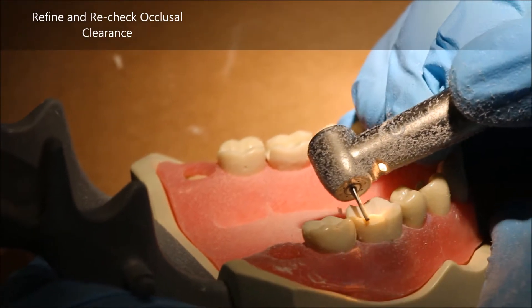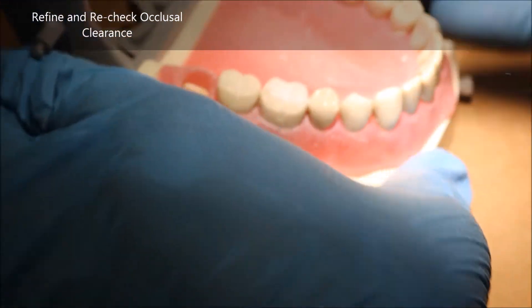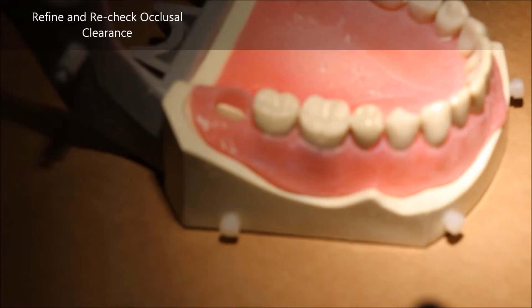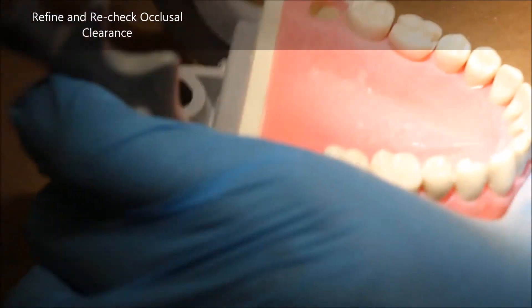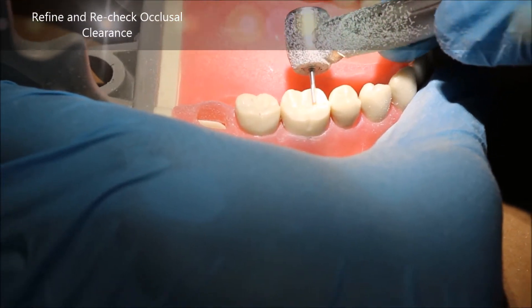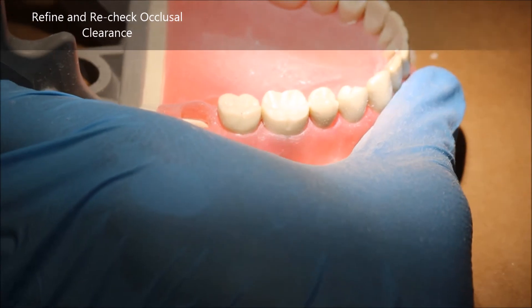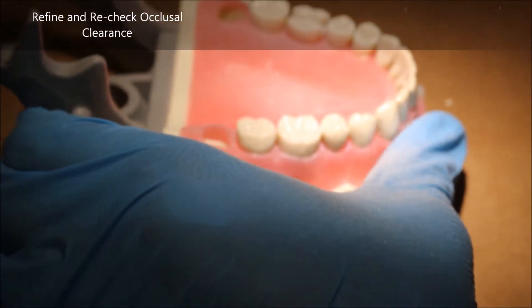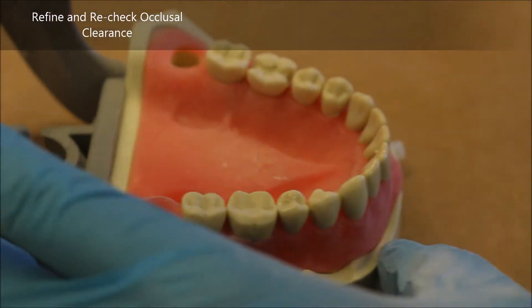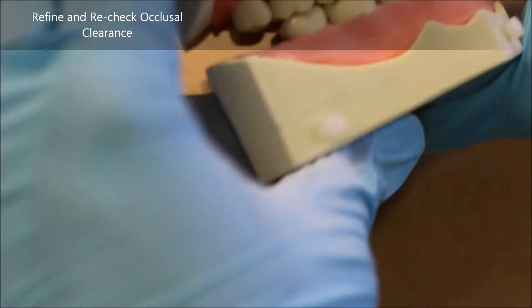Another important thing to remember during occlusal reduction is that you don't actually need to go all the way to the ends of the occlusal table. By the time you do your axial reduction, you will take off certain portions of the occlusal table completely off the tooth, so those areas don't need to be touched. This is especially true for exam scenarios where you want to stay somewhat away from the adjacent tooth, as marking an adjacent tooth is an automatic failure.